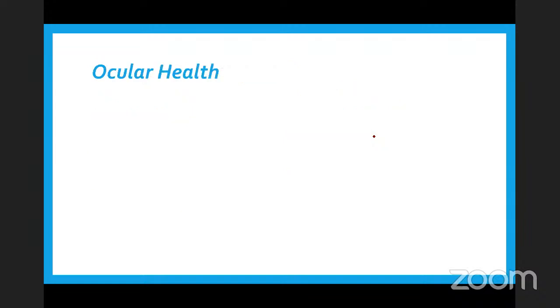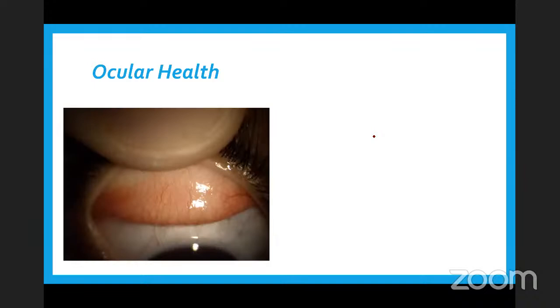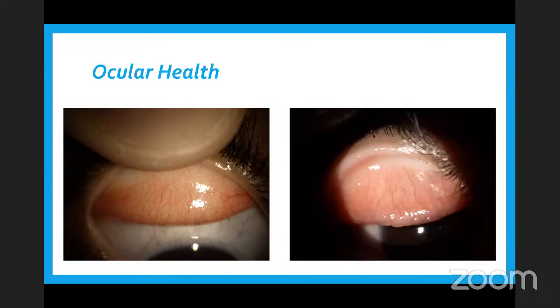So for example, you have a patient whom you evaluated during dispensing, when delivering the lens. You had a patient whose lids looked something like this. Yes, it's kind of red. The lid margins show grade 1 redness with some disturbances on the surface. But suddenly the patient comes to you for an aftercare, and you see this when you evert the lid after 2 or 3 weeks of lens wear. So something is not right, something is going on. Probably it's the lens modality. The patient is probably wearing the lens over the time of wear, or the material of the lens probably is not suiting the patient. So you can start your thought process on what you are going to advise your patient.